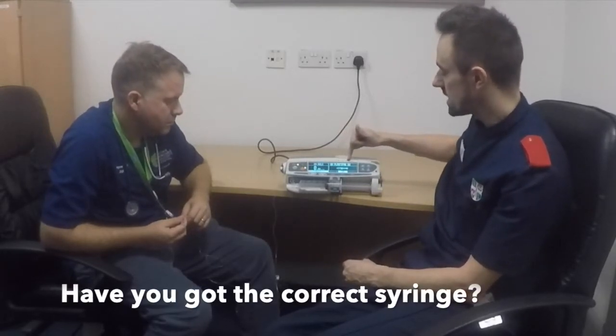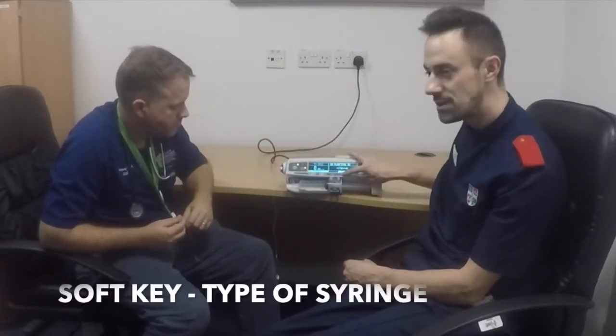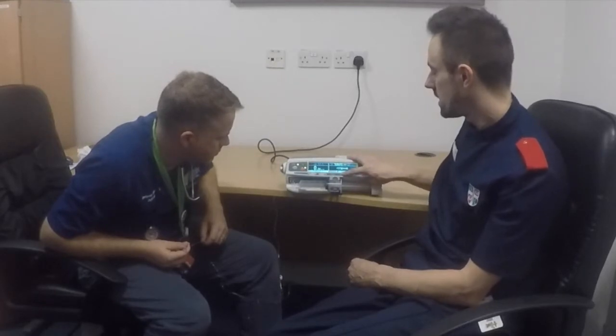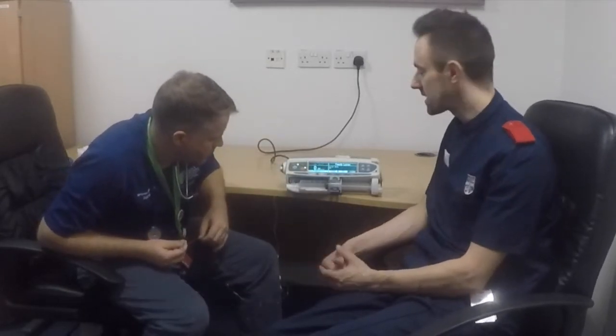The next thing it's asking is, have I got the right syringe? This is a BD plastic pack syringe, 50 mils — confirm that that is correct. If this wasn't correct, you can click on type and choose either a Terumo or a BD plastic pack. It's very important that you choose the correct manufacturer, as the diameters of these syringes do vary and that would alter your infusion rate.